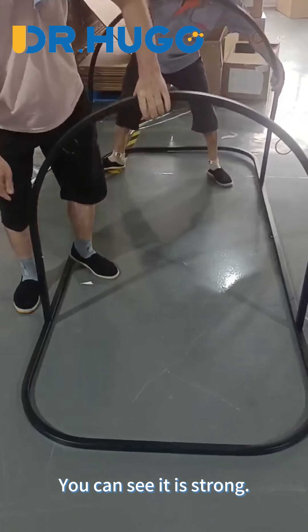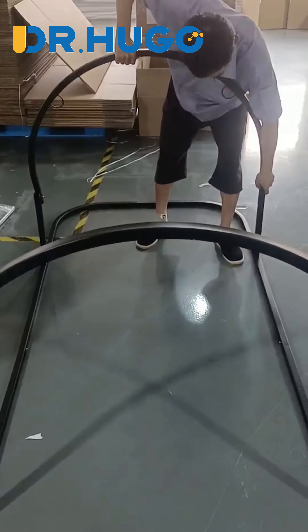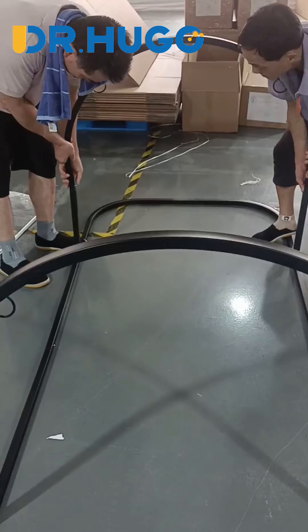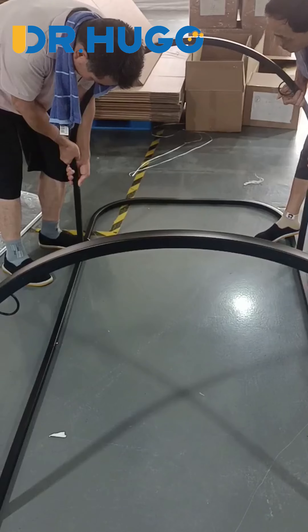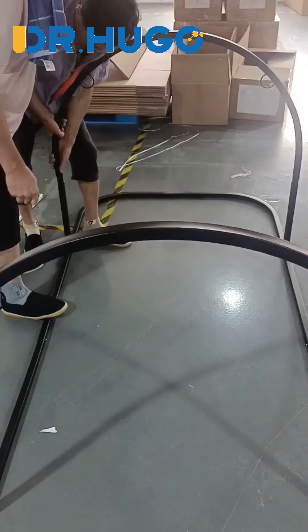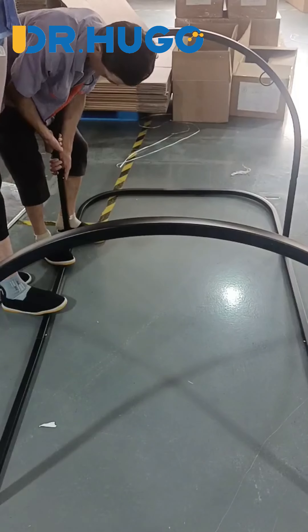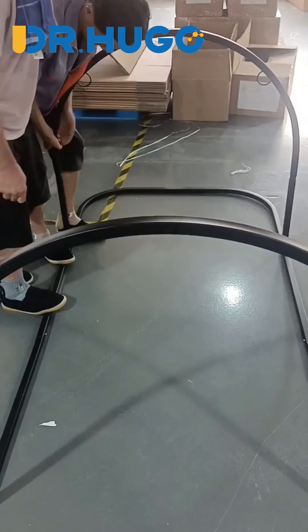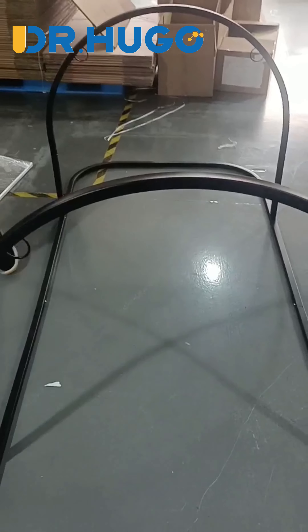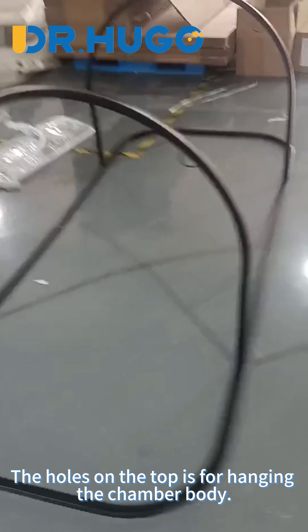You can see it is strong. Finally, we finished it. The holes on the top are for hanging the chamber body.